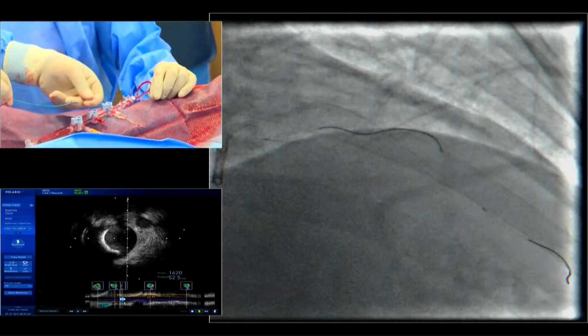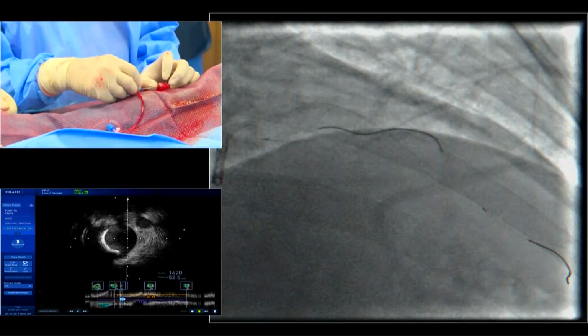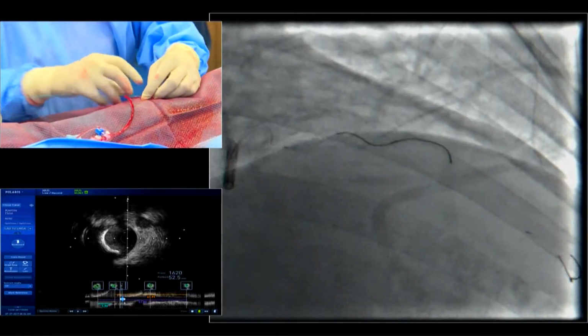No, absolutely. I'm going to the distal artery, which is not 3. That is 2.75. So I'm taking a 2.5 scoring balloon for the distal artery. Then I'll come back with a 3 millimeter balloon. 100%. Yeah, that's it.